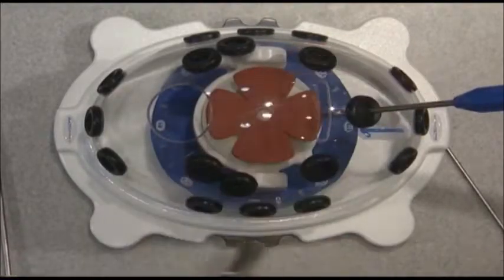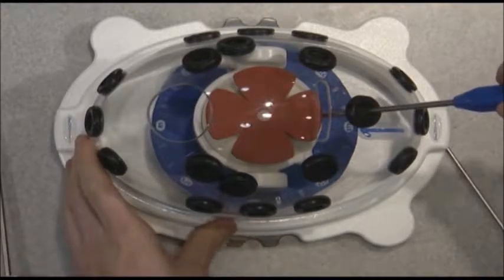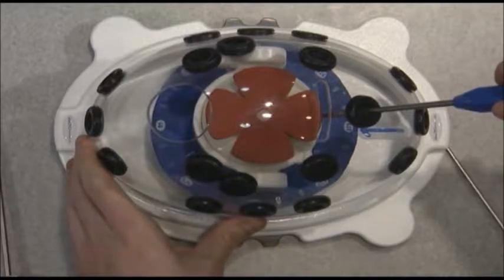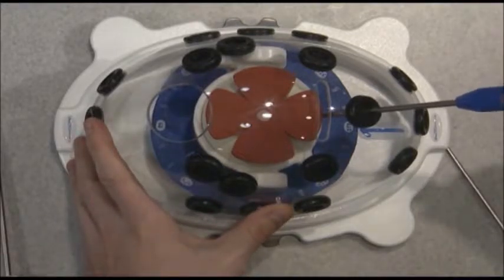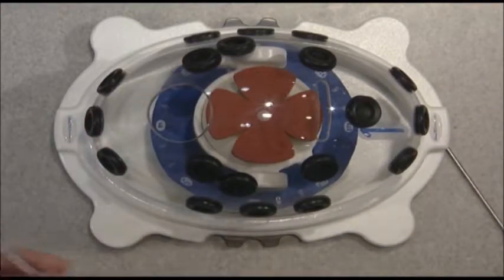These punches are usually lined with a line that tells you where to stop or what your appropriate depth for the punch is. It's important to think about your patient as you're putting these in as well. Sometimes if you have an older patient with more osteoporotic bone, you may not want to sink all the way to the line to allow yourself to get a little bit of a better bite.